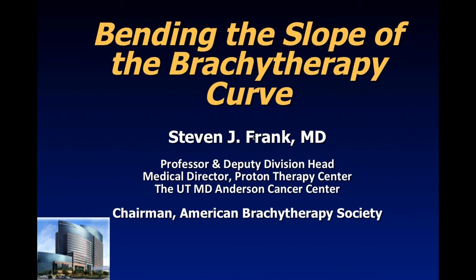Your question is asking me about boosting, like now, with the MRI, you can get where the tumor nodule is, like boosting that area. So not a standard boost, but almost like a focal boost.